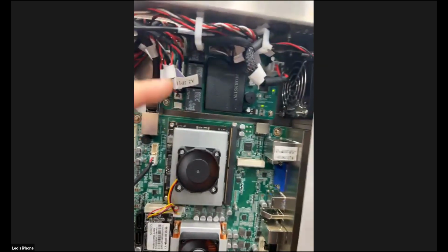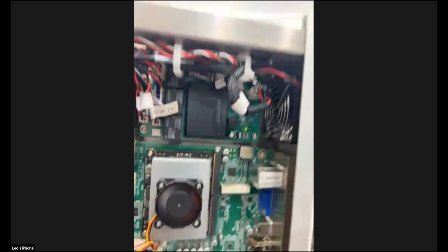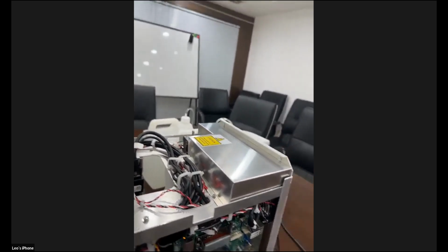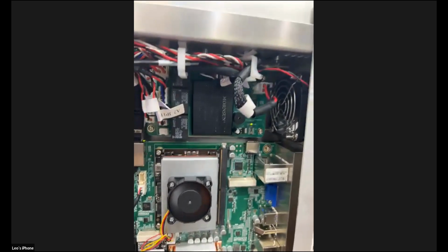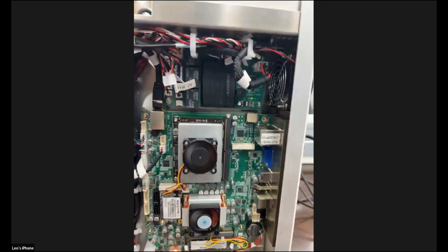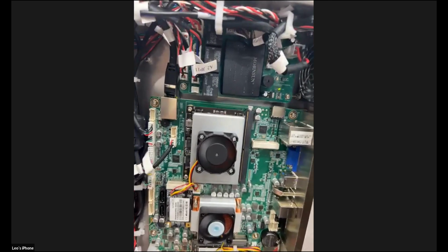And on the higher board, above the industrial board, is the power control board, because the power from the power switch module is not stable. So we need to translate it to a stable electricity, and then support the power to the A1 board and the industrial control board. So this is the module that converts the unstable electricity to a stable electricity.